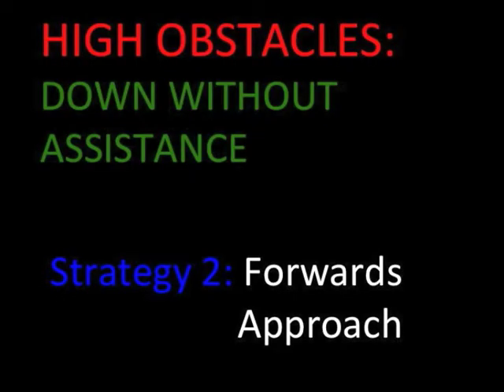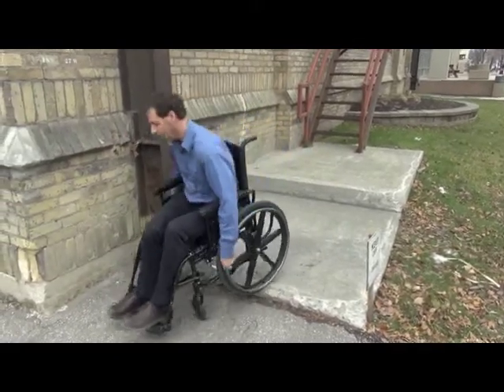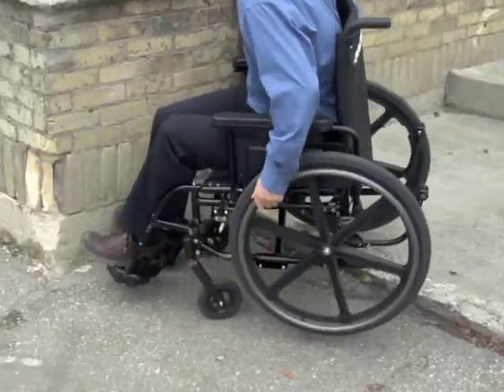With the forwards approach, we will wheel off the edge of the obstacle while popping the front casters. At first, this may not seem logical or safe. However, the biggest risk with coming off a high obstacle is having your foot rests or casters land on the lower surface, stopping suddenly and pitching you forward out of the chair.